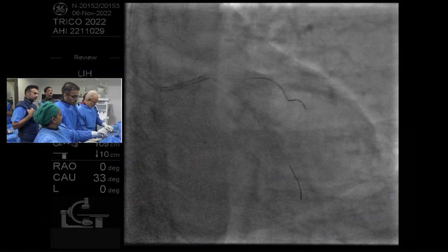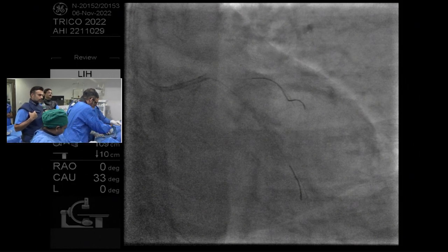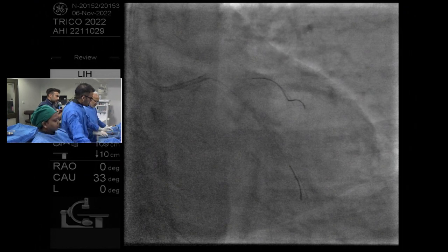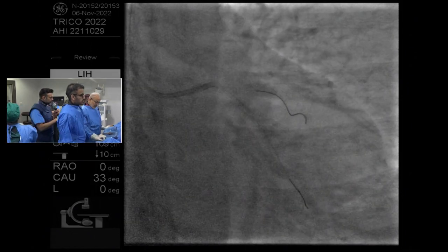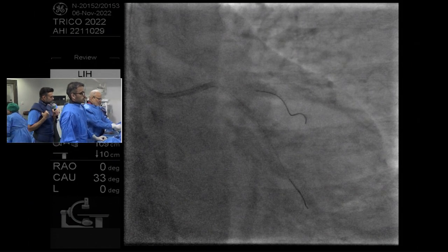That's right. Okay. So 3x15, get me NC emerge. And what you do is cone in on the proximal strut. And when you post-dilate, leave the proximal strut. Let the shoulder of the balloon get that. You can go in even further if you want to at lower pressures, but then you've got a fully expanded stent.